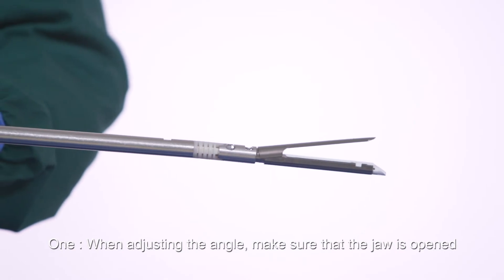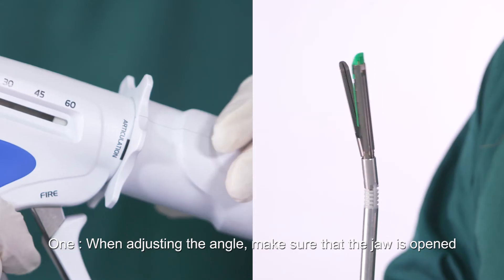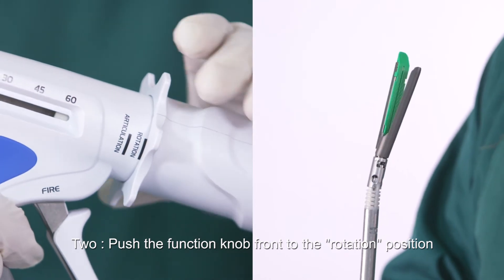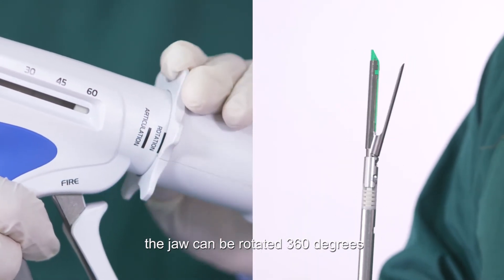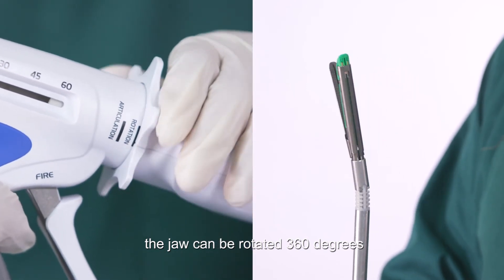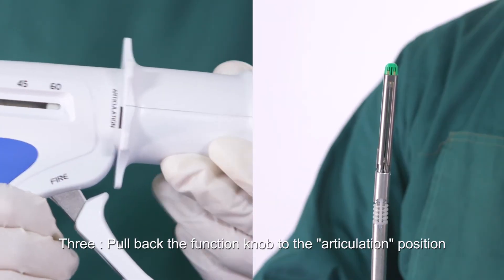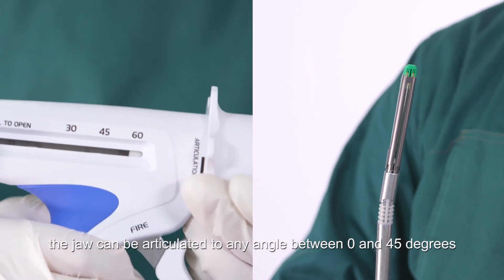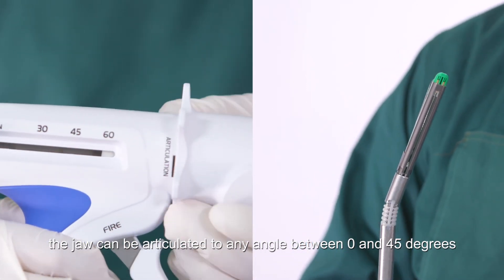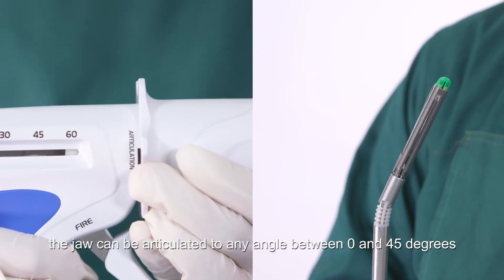Adjusting the angle of the instrument jaw: when adjusting the angle, make sure the jaw is open. Push the function knob forward to the rotation position — the jaw can be rotated 360 degrees. Pull back the function knob to the articulation position — the jaw can be articulated to any angle between 0 and 45 degrees.